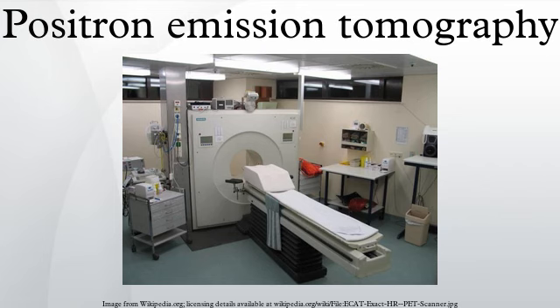Average civil aircrews are exposed to 3 mSv a year, and the whole-body occupational dose limit for nuclear energy workers in the USA is 50 mSv a year. For scale, see orders of magnitude. For PET-CT scanning, the radiation exposure may be substantial, around 23 to 26 mSv.